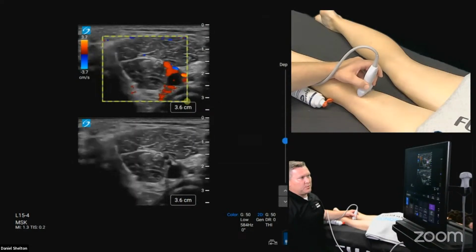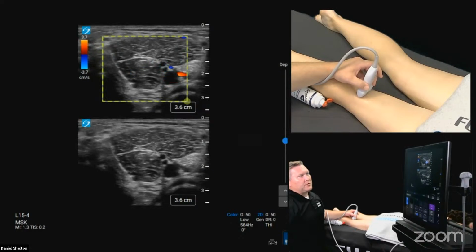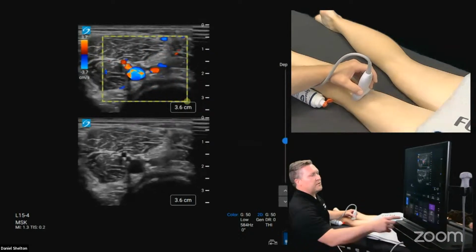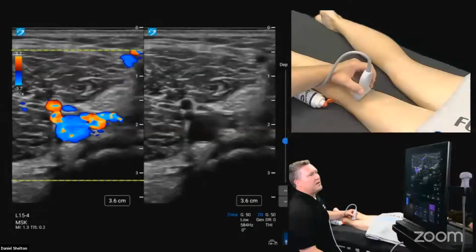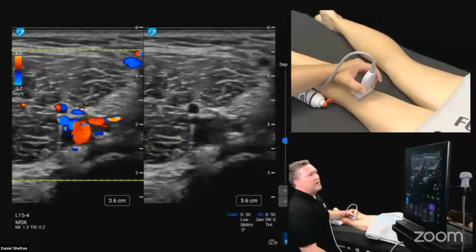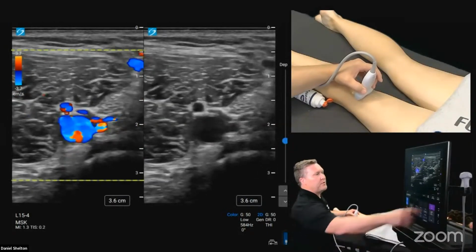So you'd be watching the bottom screen and watch your needle drive near the vessels, or if you're doing a nerve block, that's also good practice. If you feel confident that you can keep your structures in the middle of the screen, you can activate the left-right button on your ST or PX or LX. This is all 3 machines right now. And it's more full screen, but it does cut off the edges of the transducer unless you drop your depth.